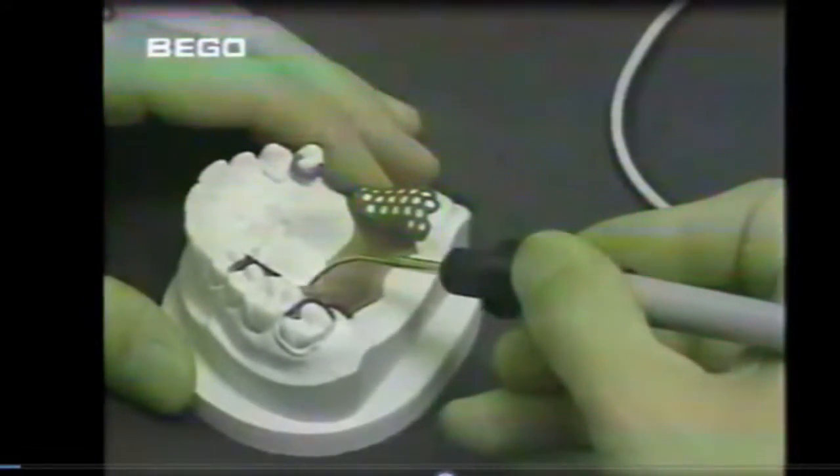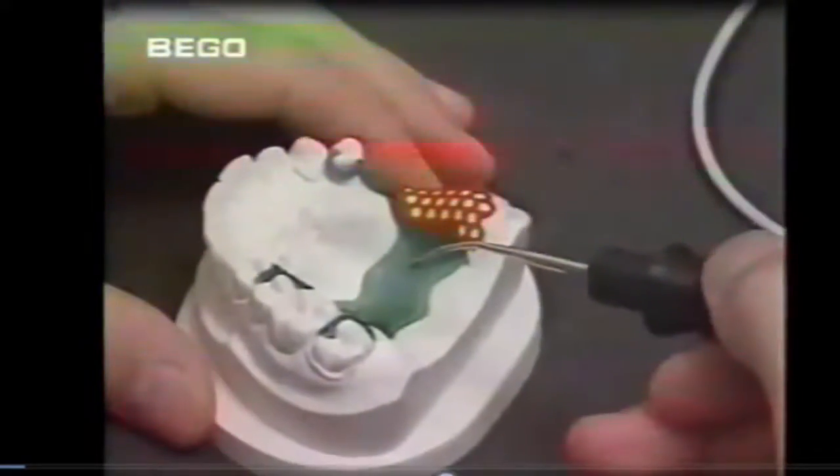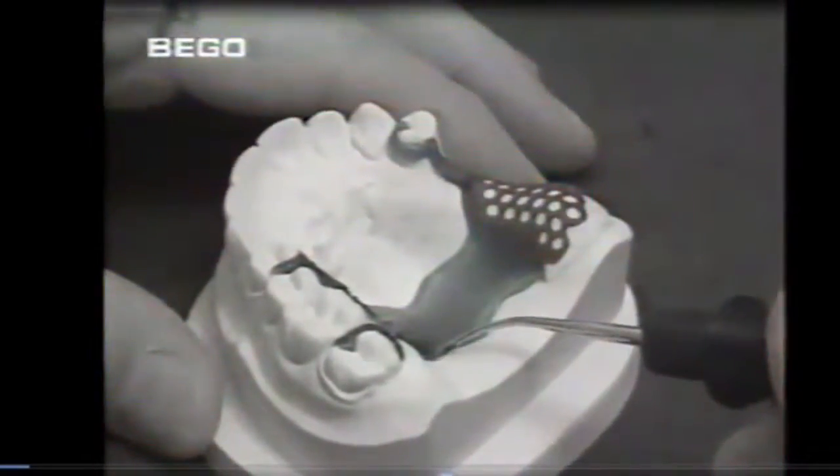This wax-up is to be cast with the Fornax high-frequency induction casting machine. The wax-up is carried out in such a way that no part of it can come off the model during fixing of the sprues and investment. Since they have a wide surface in contact with the wax-up, flat casting strips with a cross-section of 2 by 6.5 millimeters are very suitable for centrifugal casting.